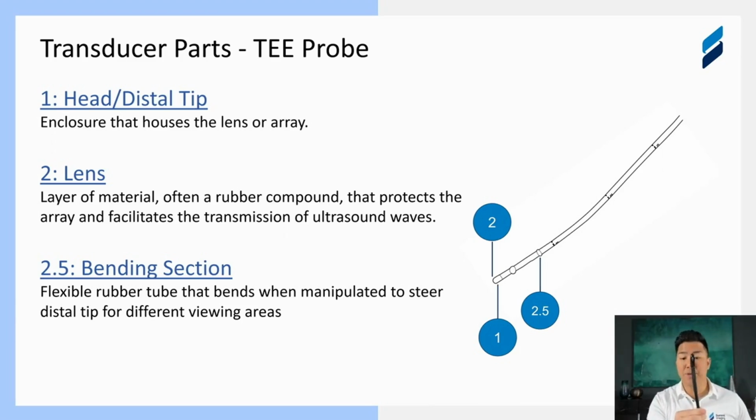it suffers the most damage because it swings around so easily. If you have the handle here and you move the handle, the distal tip moves as well, but at a far higher speed because it's whipping around, and it can take a lot of damage. What we think is a small movement on the handle side swings that tip, and it can hit the side of a door, the side of a machine, the operating table, the floor, whatever have you. There are really fine electronics in here, resulting in that kind of impact. It's a really sensitive area that you want to take care of in every single phase of the life cycle of this transducer.